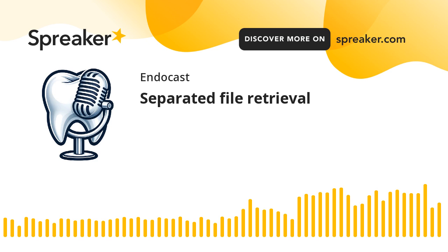I totally agree, and I believe also the same concept of the inner wall applies also in retrieval as in bypass that you mentioned in the last episode. But we have a different tool now than the files. The files are easy to pre-curve on the inner wall, but we have the ultrasonic tips. So, can we do something for the ultrasonic tips to make them more adaptable to be pre-curved and introduced in the right place?